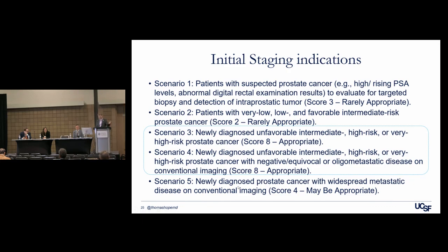That's a little unusual because there's this weird thing now where people are actually getting CTs and bone scans still, and then you're trying to decide if you want to get a PSMA PET once you've already had a CT and bone scan. In a year, presumably no one will get CT and bone scans anymore, and so this isn't a relevant indication, but there's sort of an overlap time where you might have patients who have frank mets, and obviously if you have frank mets, there's going to be no clinical benefit of getting a PSMA PET.